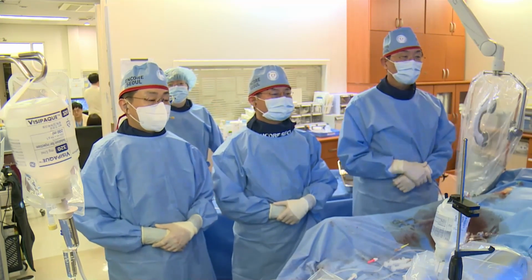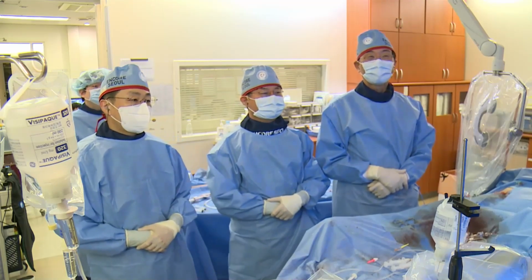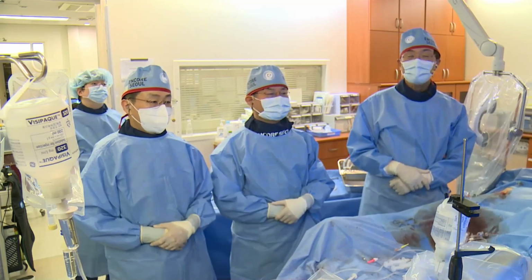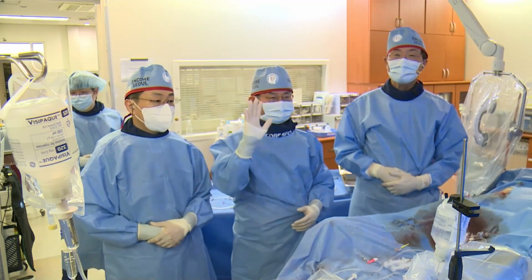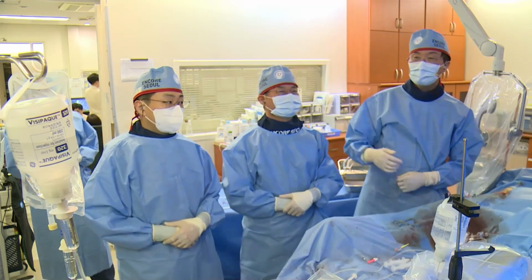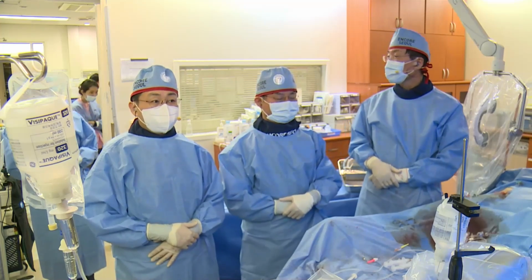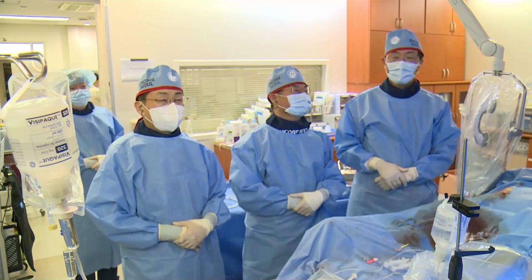So we have a CTO case, specifically CTO bifurcation. I'm quite excited to do this procedure. My name is Hyeon-Cheol Gwon from Samsung Medical Center. The second operator is Ju Han, the same hospital, and Woo-Jin Jang from the Jungang University Hospital. Sang-Yun Lee is my fellowship trainee, working as a fourth operator.